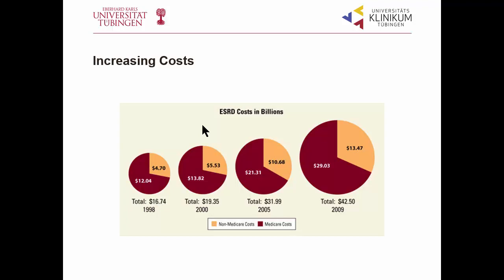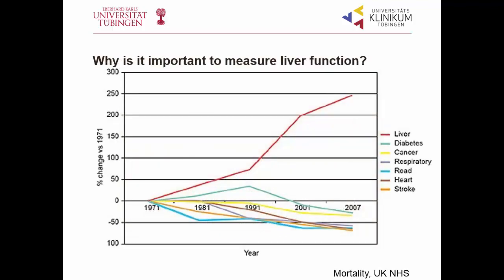If you think of biomarkers for end-stage renal disease, we have glomerular filtration measured with blood tests, which are not very sensitive, and we have invasive biopsy, which comes with all the complications, and we have nuclear medicine tests. So it would be good to have a non-invasive imaging test to measure glomerular filtration and also perfusion of the kidney. Same goes for the liver.